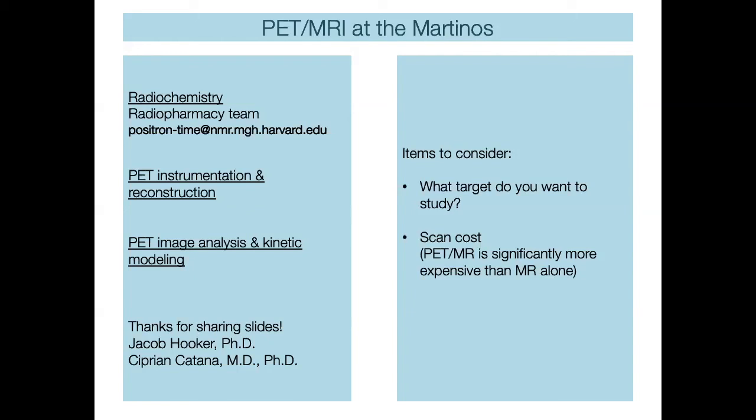And so finally, just consider what are the targets you're interested in your study. And of course, scan cost is also an issue, and compared to MRI, PET adds on a significant component because it takes a big team to get PET scanning going with the radiochemistry.